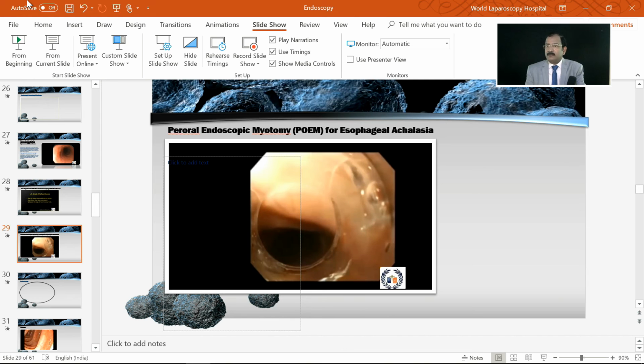Pardon? White balance. Do you know white balance it needs? Here it is already a button there, white balance, we will show you. White balance is necessary, focusing is not necessary. Because it is an endoscope, so it is a CCD, here it is a chip on tip technology. There is no lens ahead of CCD. You got the point? So in laparoscopy, in front of CCD there is lens, isn't it? So you have to focus.